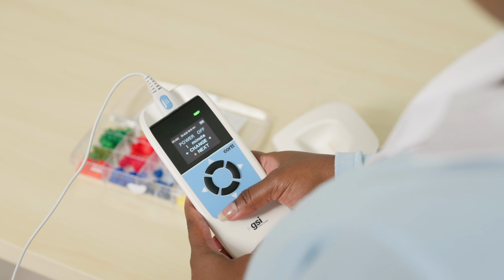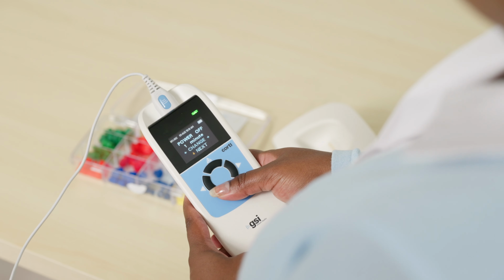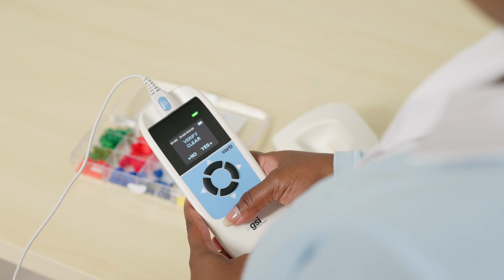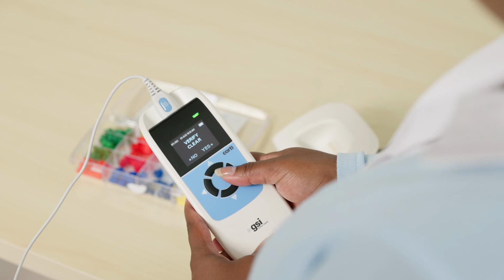From this menu, you can scroll through the settings using the up or down navigation buttons. To change the settings, you will use the right and left navigation buttons. Any changes that are made in the instrument setting menu will be saved automatically. To exit the menu, continue to scroll down until the Corti returns to the Ready to Test screen.